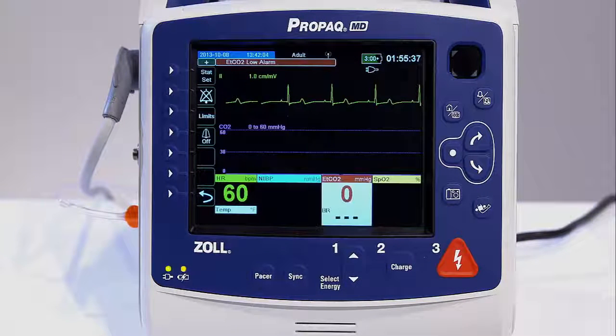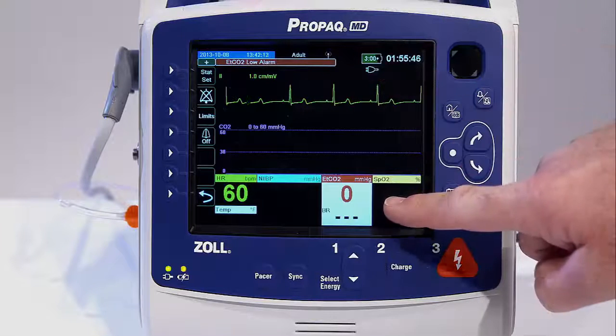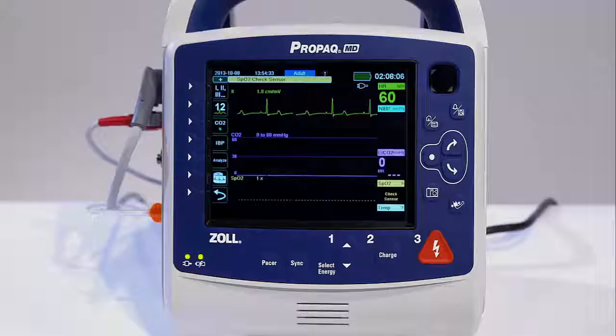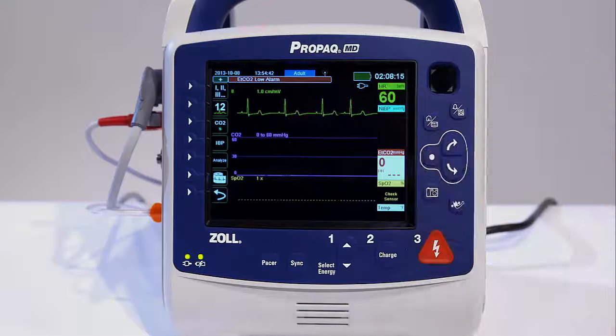Vital sign and equipment alert messages give multiple visual indicators to make alarms easily identifiable and user-friendly. Troubleshooting is quick and easy. The Propaq lets the user know of an alarm situation in a number of ways. The parameter window indicator shows the alarming parameter in red against a white background. There are also LED lights on the top of the device that are visible from both the front and rear.